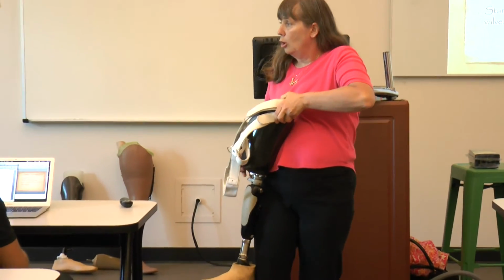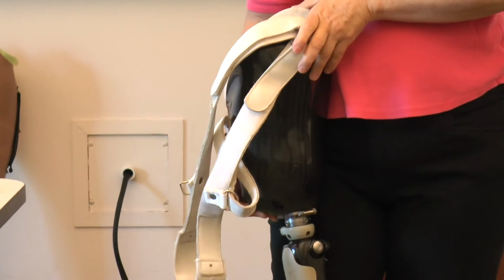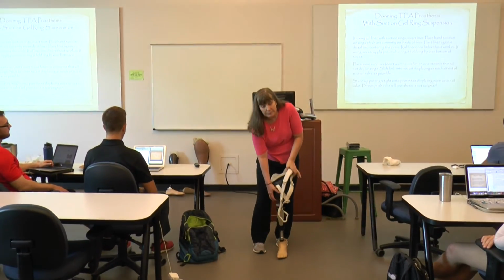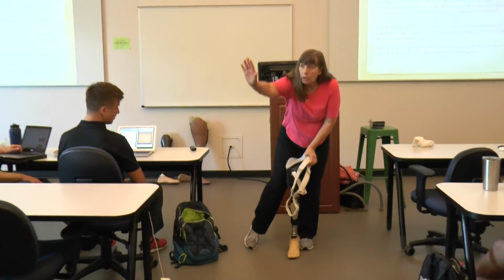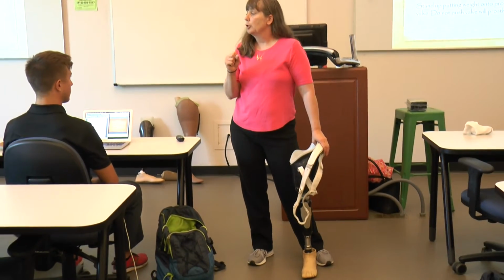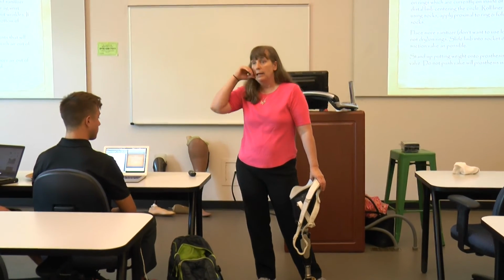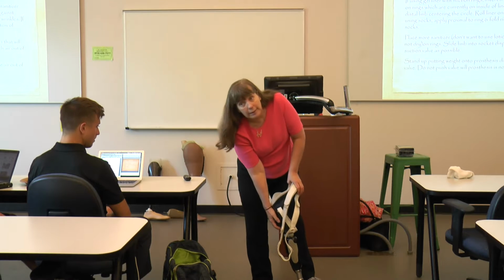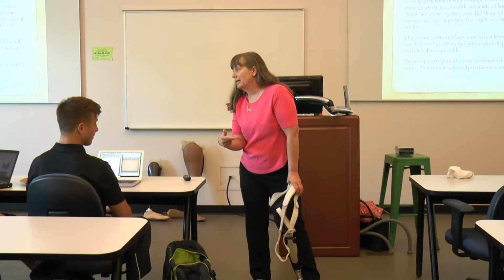Okay, if I push it and hold it, it opens it up and lets a larger amount of air escape, but it also lets air in if I take the weight off of my prosthesis. So if I put weight on it and push down on this left side, let go of the valve, and then take the weight off, it will secure it better, because you let a little more air out, you get deeper down in it. Okay? But what I don't want to do is push the button, lean over here, take the weight off of it, because then I just let all that air back in.